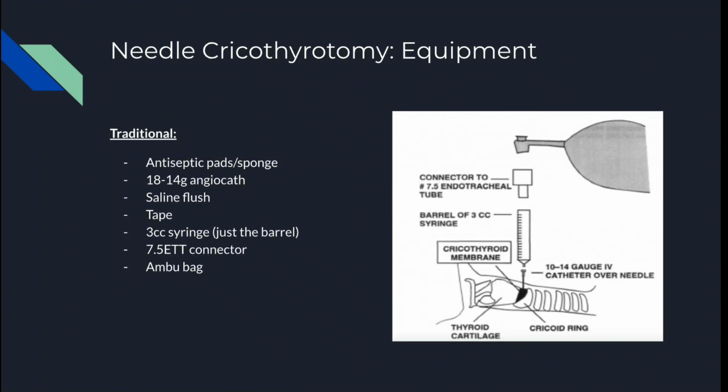We'll obviously need an angiocath. Remember, bigger is better. And that being said, obviously, we do have bigger options that we would use for our needle decompressions, 10 and 12 gauge angiocaths. But while there's a larger diameter, understand that those catheters are much longer. They're 3¼ inches to be exact, which is quite a bit bigger than our standard 1.5" IV catheter.